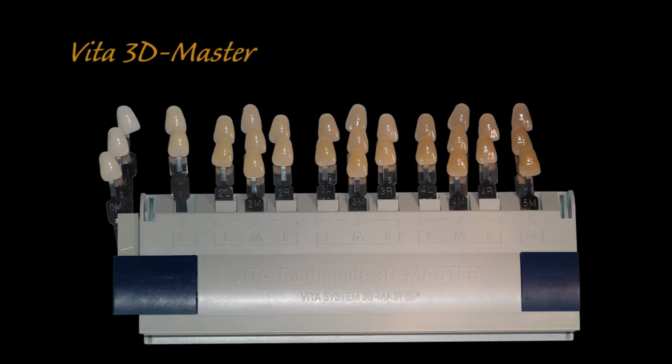I want to reference another shade guide, the 3D Master Shade Guide. Now this shade guide is an excellent shade guide on how to communicate back to the laboratory the shade that you're actually trying to achieve. As you notice on the left side of the shade guide, there is an add-on shade guide. It does come with the shade guide when you purchase it, but it's called a bleach shade guide. So obviously that's for the teeth that are really white, bleached out. But it comes with a vast array of different shade guides.